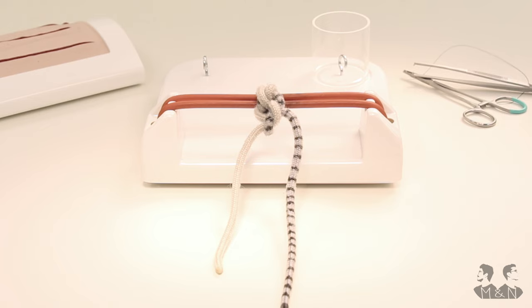The full surgical tie is a combination of the single knots we showed you in the previous videos. The final knot is equal to a surgical tie made with the instrumental technique.